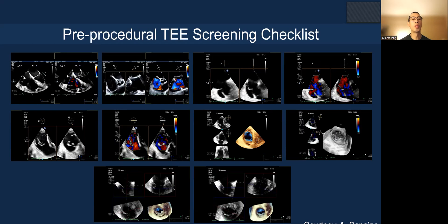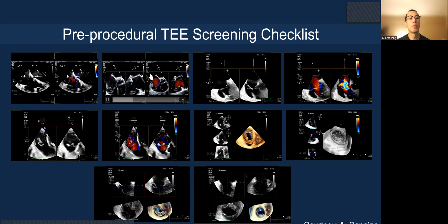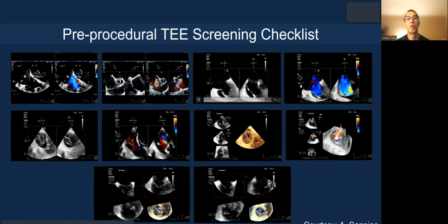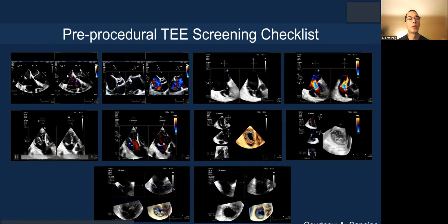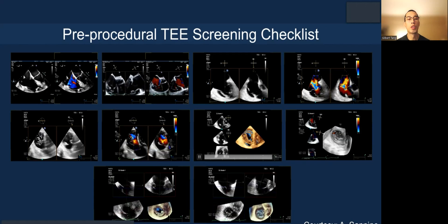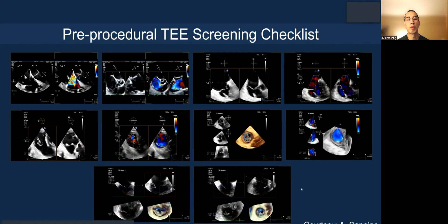Here are some of the pre-procedural TEE screening checklists. Starting with the top left, which is the four-chamber view, this is the RV inflow X-plane grasping view. This is a deep esophageal X-plane view with color, a transgastric en-face view, X-plane, and with color. And here is the 3D en-face with multiplanar reconstruction and with color.